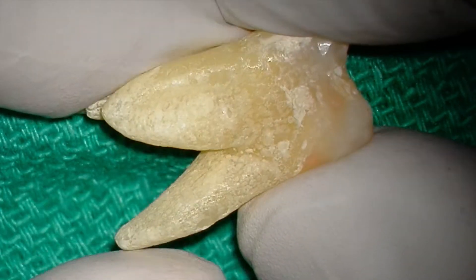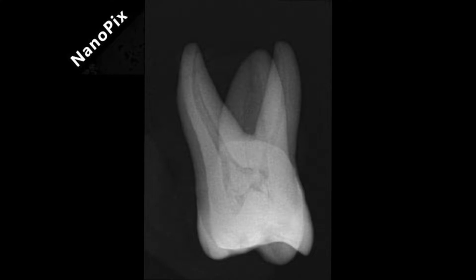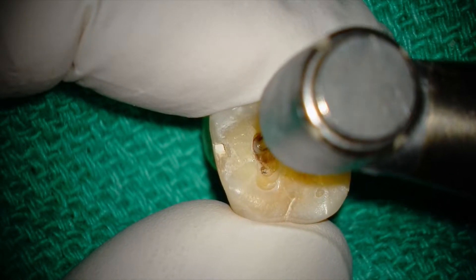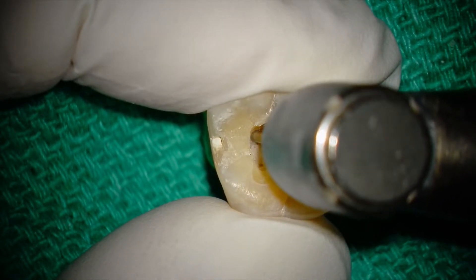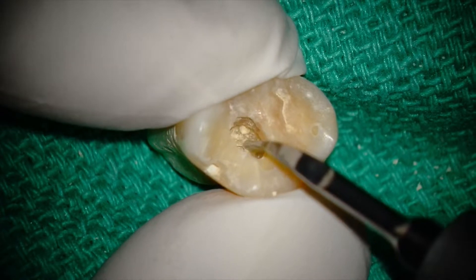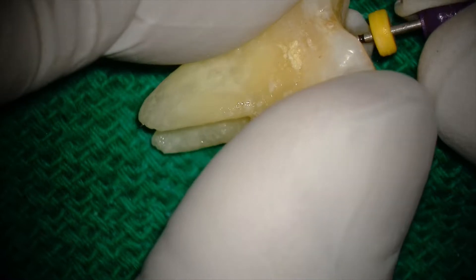Alright, let's tackle this maxillary first molar. We're gonna use both files to treat the buccal canals. Let's see the E-Flex 1 and REC in action. This extracted tooth has a large pulp stone, but it's absolutely no match for the Ultramint Pro. After accessing the tooth, there's that sneaky calcification. The Ultramint Pro easily reduces the calcification and we're on to establishing a reproducible glide path for the number 10 file.